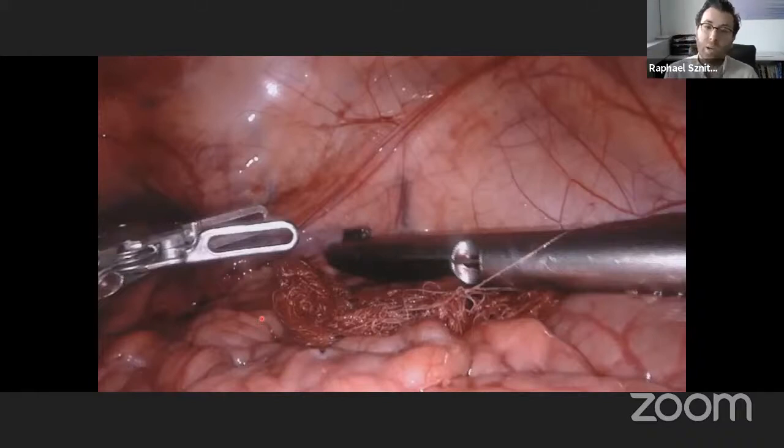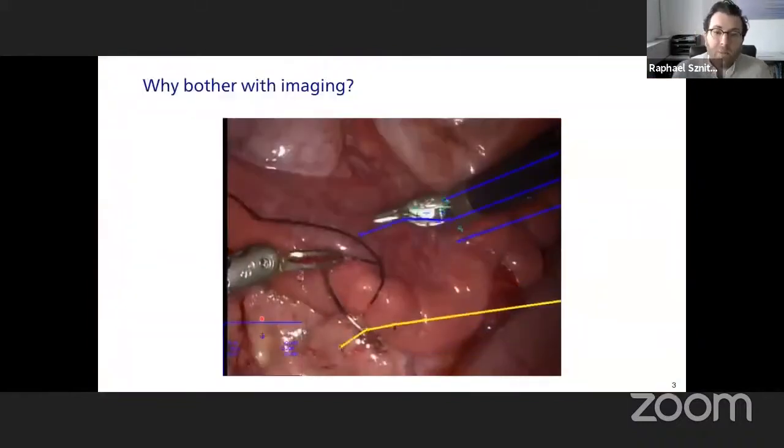So are you coming close to a structure inside the body that you should pay particular attention to, and so on? You might wonder, well, if you have a robotic system, why do you care about looking at imaging? That's a very normal question. This is a visualization provided by Austin Ryder, who used to be at Columbia, highlighting the difference between what the robotic system's actuators report, when you overlay them on the imaging.